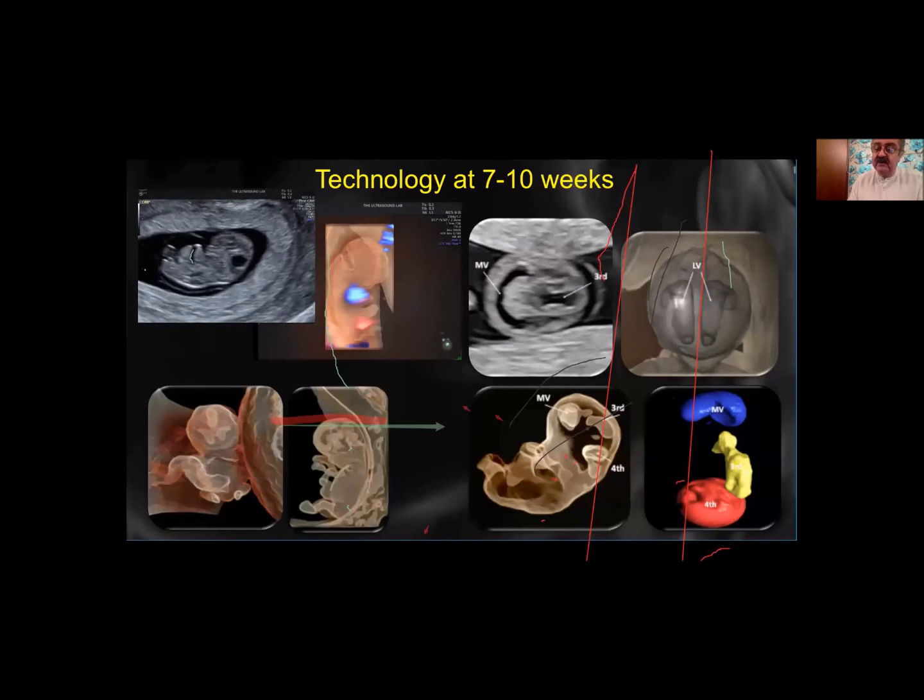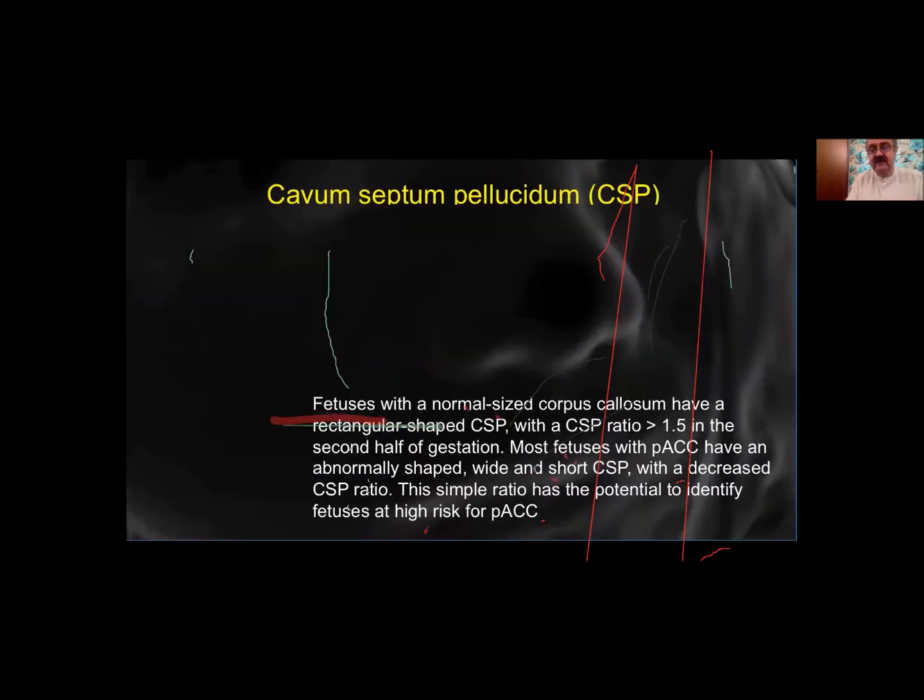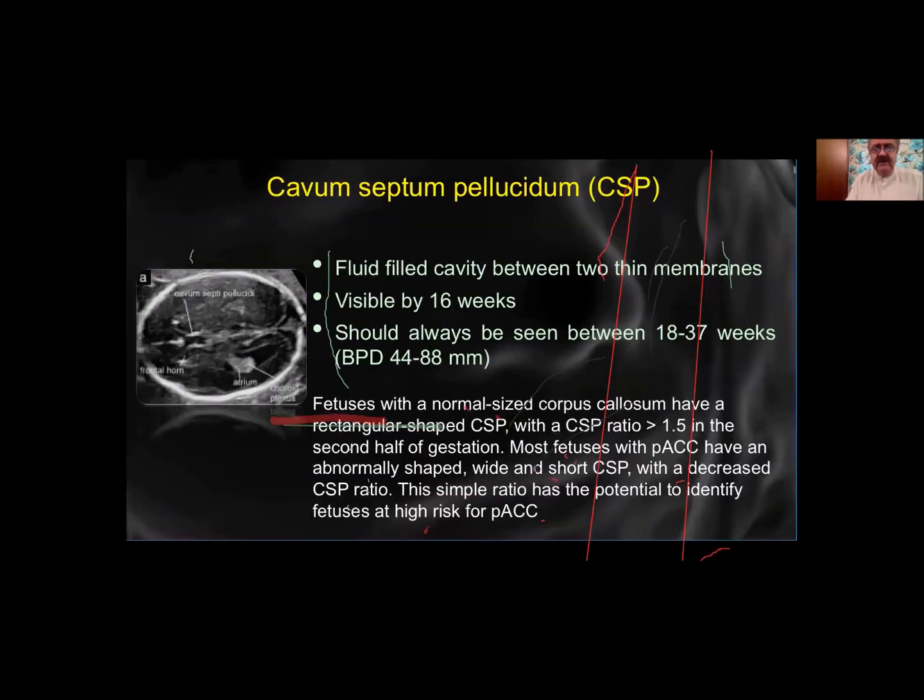And we can pick up here a dilated fourth ventricle as early as 10 weeks of gestation with the monoventricle, confirming for me that this is truly a holoprosencephaly. So it's going backwards, but at the time of the anomaly scan, I must be able to pick up neural tube defects at about 99%. The next important structure I'm going to discuss is the agenesis of the corpus callosum, because you see it about once or twice a year and you have no idea.